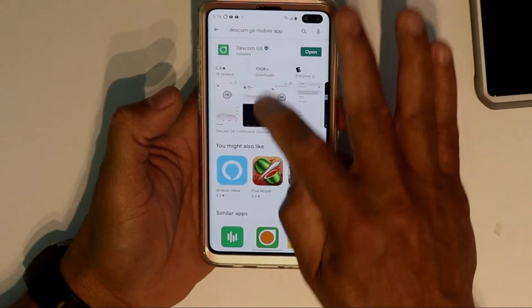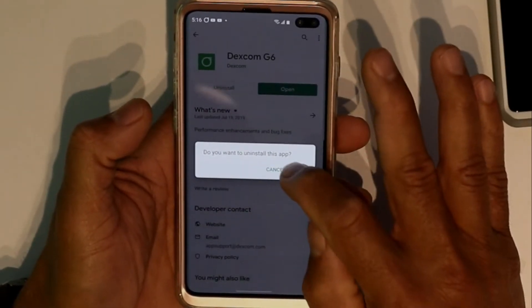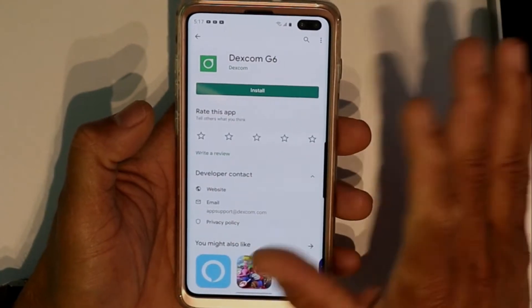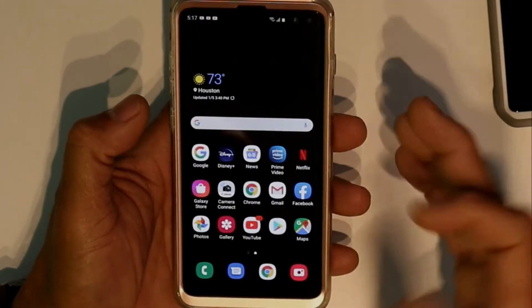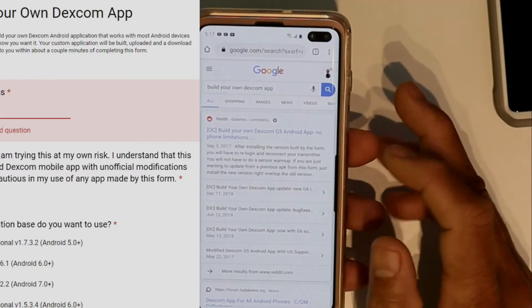The first thing we're going to do is — we have the Dexcom app right there — we're going to uninstall that one. Take it out completely so it's gone. Then we're going to go to Google and search for the Dexcom app.